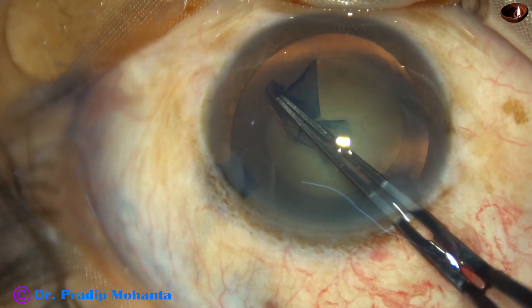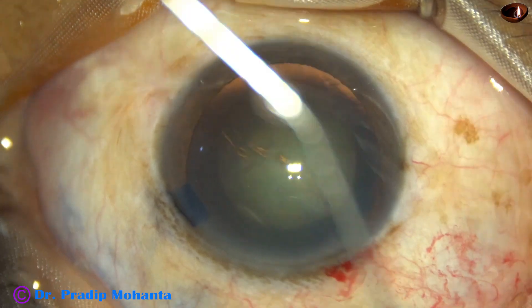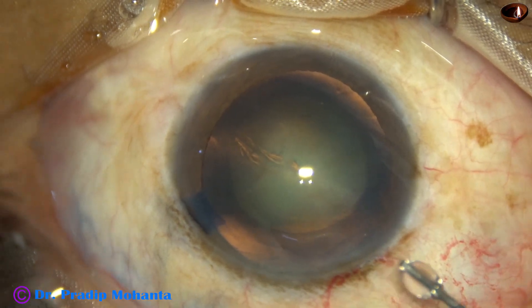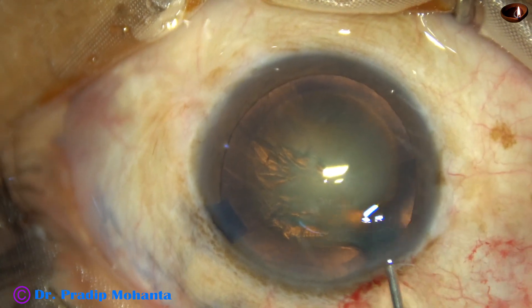All the time, the anterior lip of the main wound is lifted off. And now, hydrodissection is done with balanced salt solution and this 27-gauge cannula.